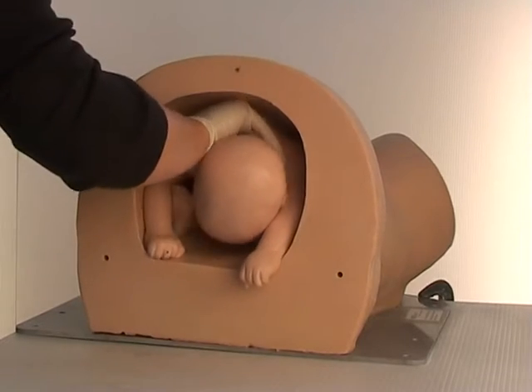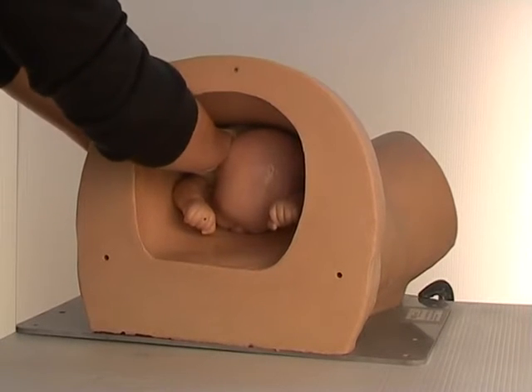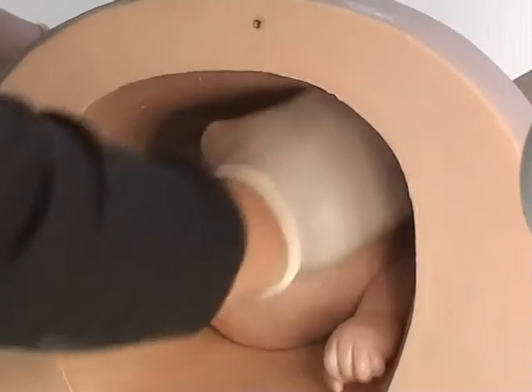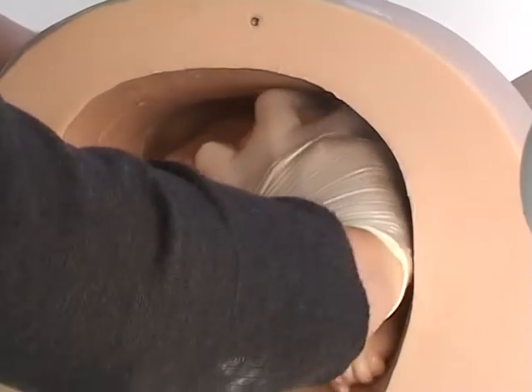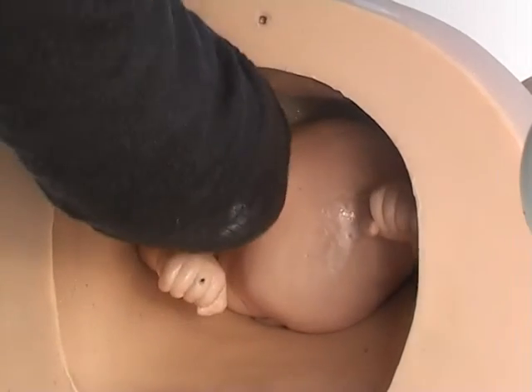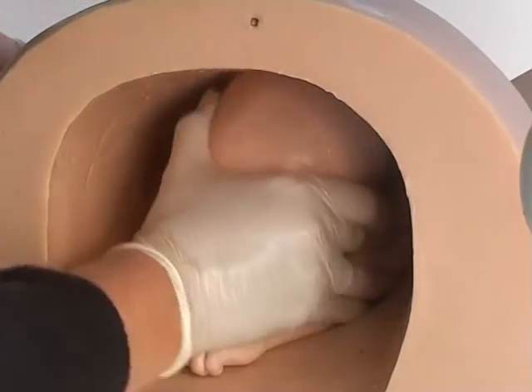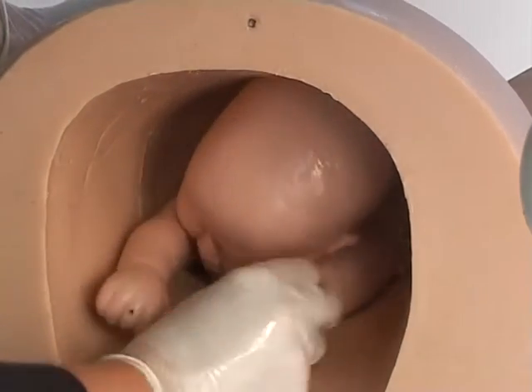Your hand will be on the back of her neck, pushing on her shoulders to move her into the birth canal. You can push on Sophie's head to continue her movement through the birth canal. Always ensure that her arms are in front of her body and not behind her head, as this can put undue stress on her skin and skeleton.